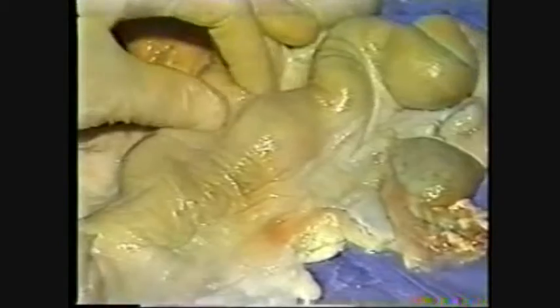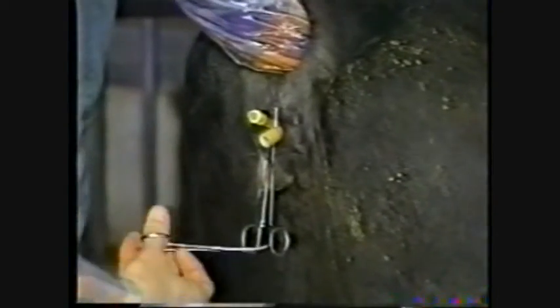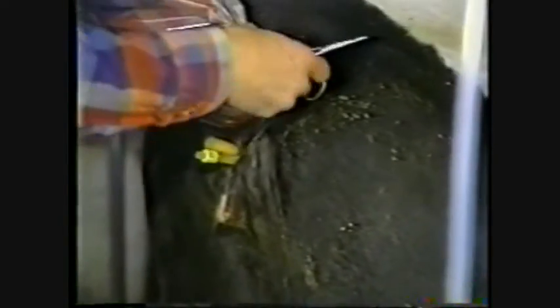Let's go one more cc of air. Feels pretty good. We'll stop. We'll take our hemostat, clamp that off. Break loose now. Take our stylet back. Set that back in the catheter packet to keep it clean. Take another hemostat. Loop it through. Bring it up. Try and grab a piece of hair.